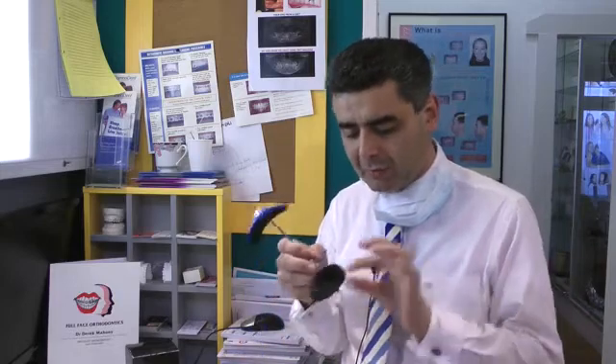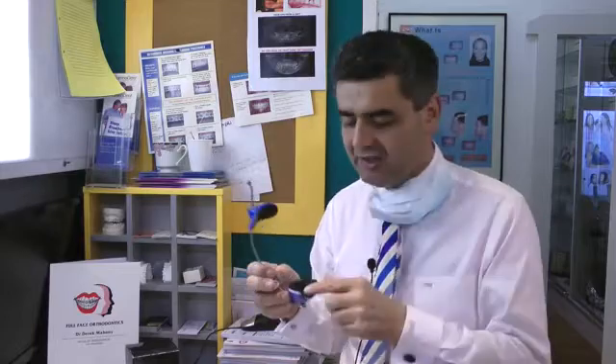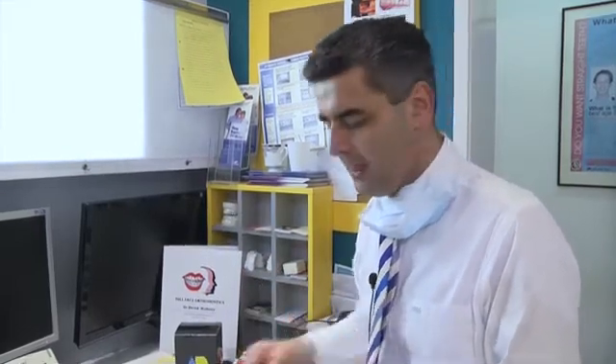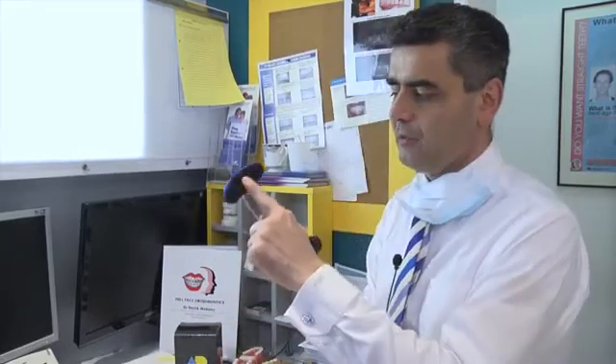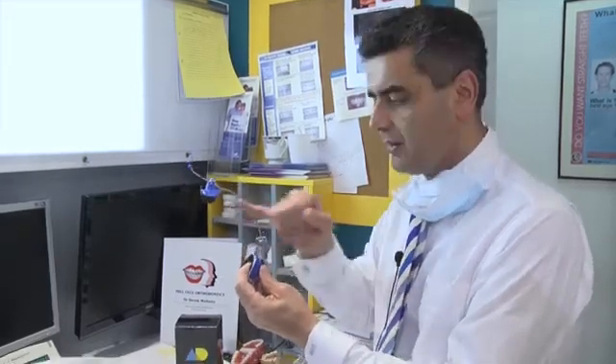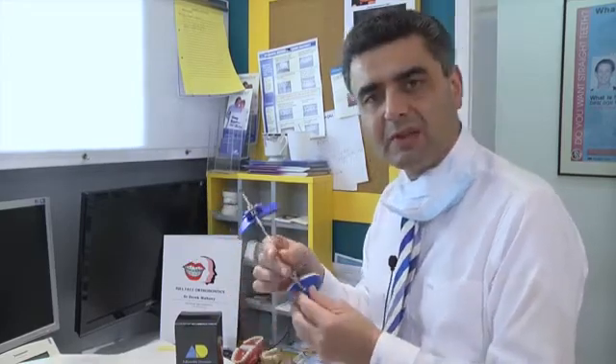I've had one or two patients that we've actually fully customized this. We've taken an impression of the chin and my technician with cold cure acrylic has actually customized it to the chin — that's like a bespoke face mask, but a lot of extra work goes into that. As far as the pads, there's the forehead pad and the chin pad. Looking at it from the side, the direction of pull is in this method. Very comfortable to use. I've had very good compliance with these face masks. Now let's go to the clinic and actually fit one.